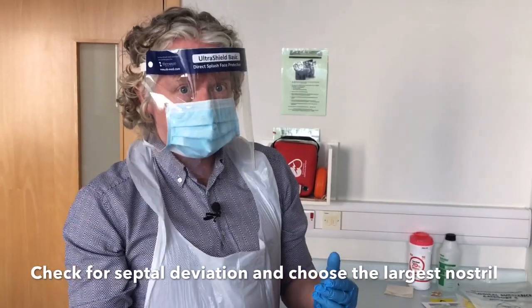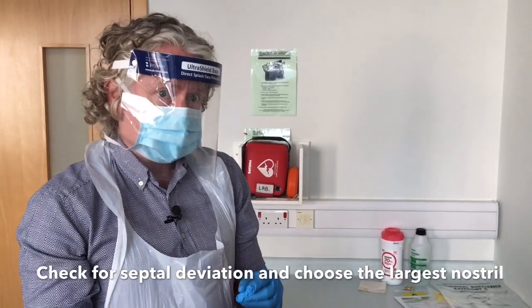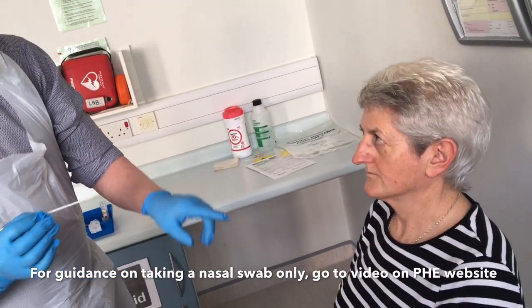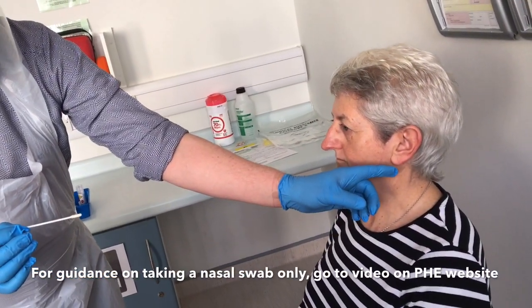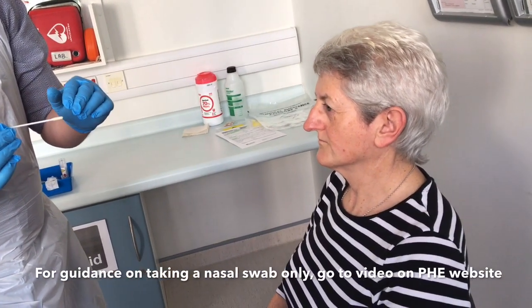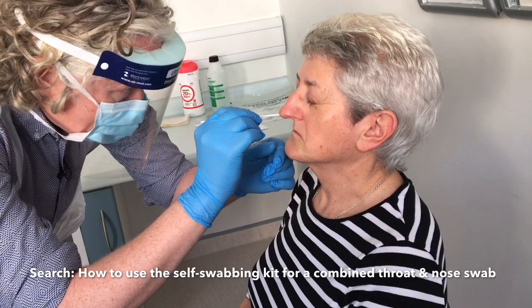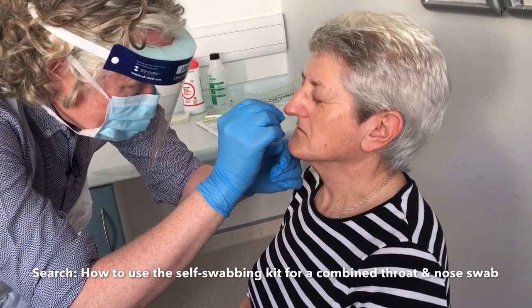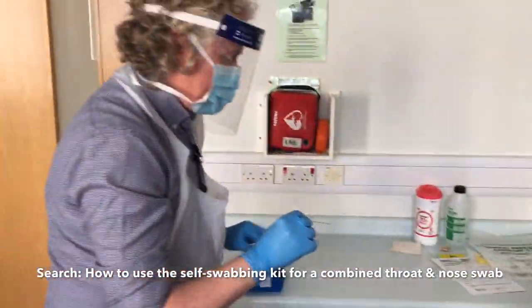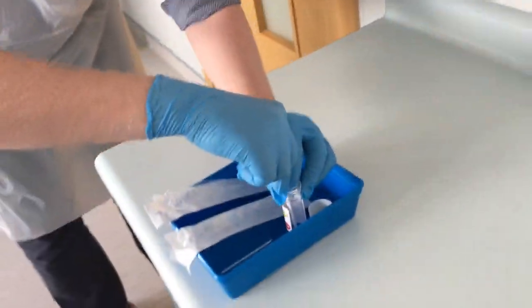With the nose swab, if you're familiar with passing a nasogastric tube, this is exactly the same direction and placement. We're going to place it into the end of the nose, aiming back towards the lower lobe of the ear, running parallel to the roof of the mouth. That may well be uncomfortable for the patient, but we are trying to get right back to the back of the nose.